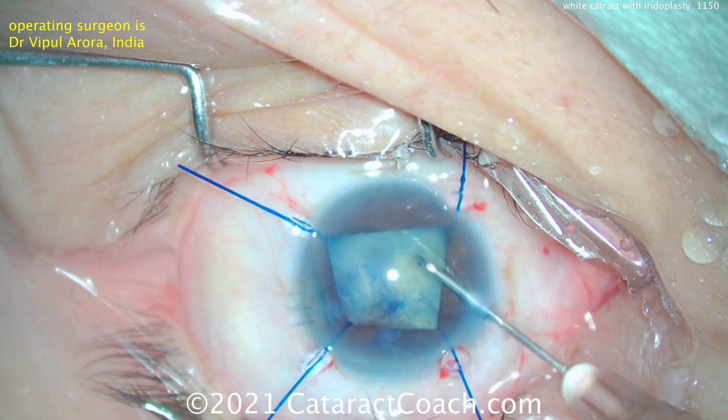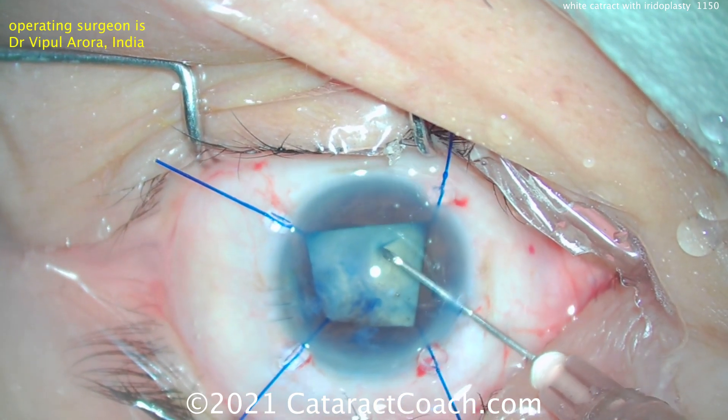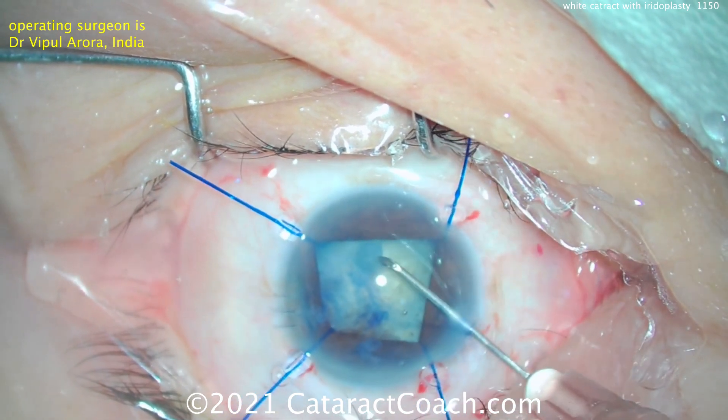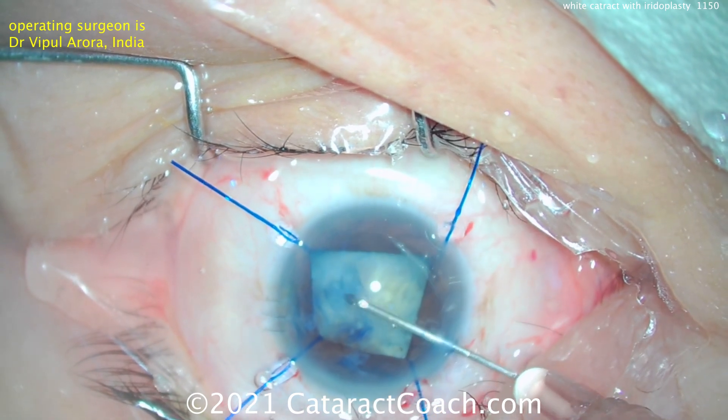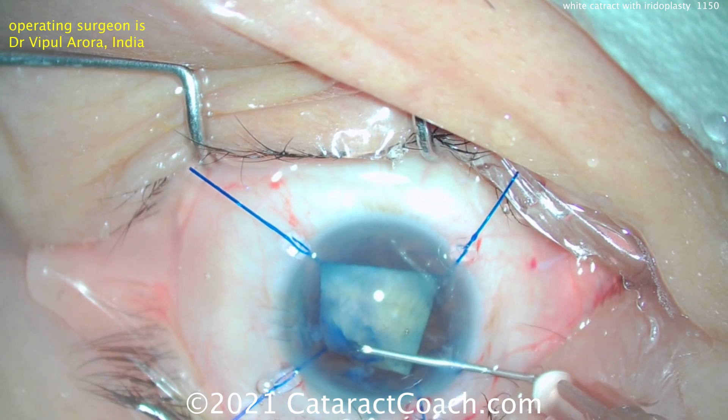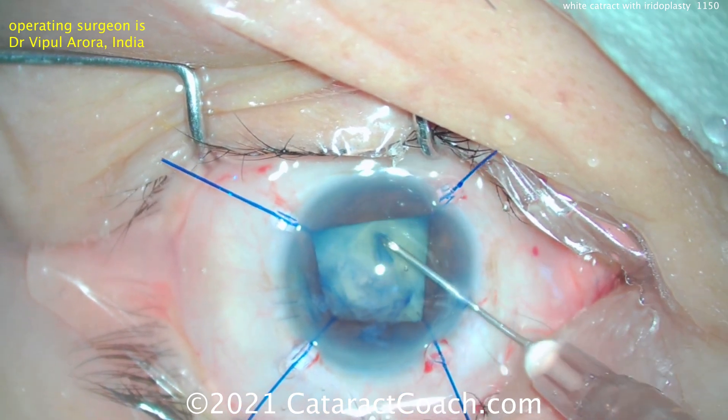You can see there's already some fibrotic change here. The capsule doesn't look like it's super strong either — maybe a little bit of zonular weakness. A little bit of wrinkling as he's trying to make that opening. But he does a beautiful job here, and using just the cystitome creates a nice round capsulorhexis.